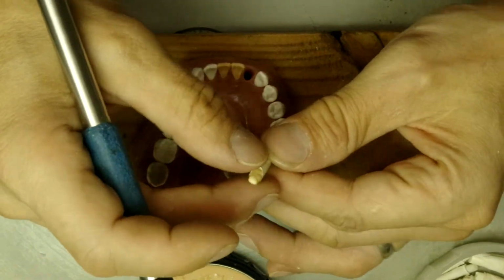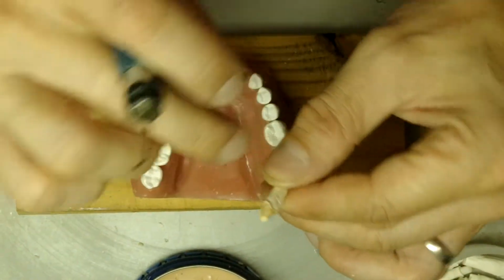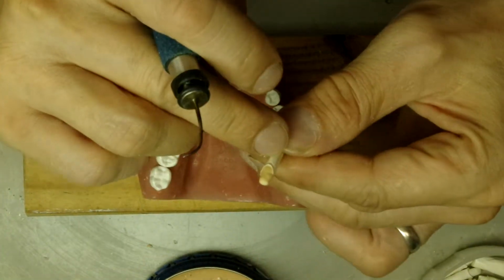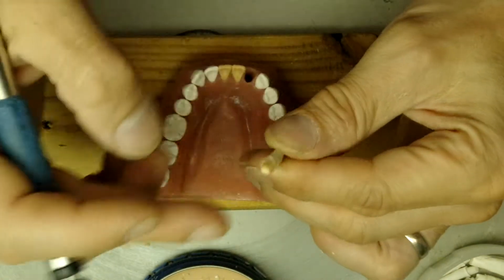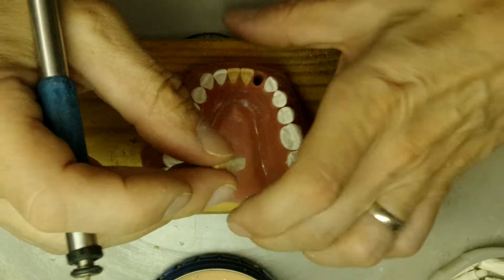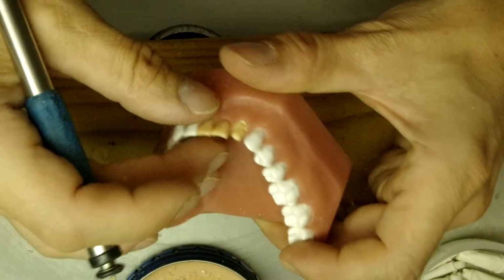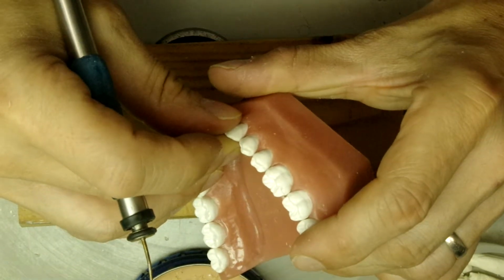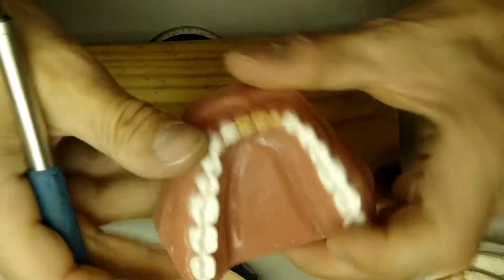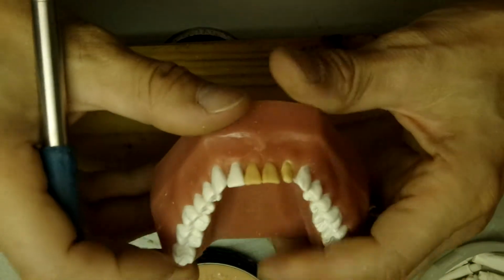So when we put it in, we know which side is the mesial, which side is the distal, and by that fact we know which one is the facial or labial and which one is the lingual. Push it down. Remember how you hold it. 2 fingers, labial and lingual. Push it down. Check to make sure the margins are below.